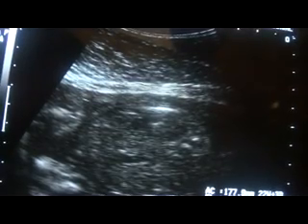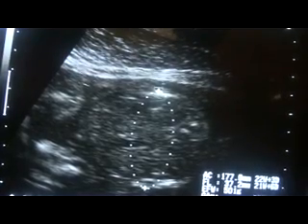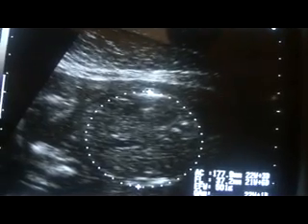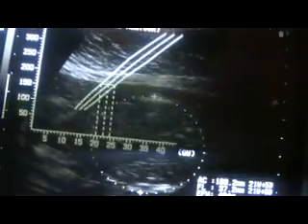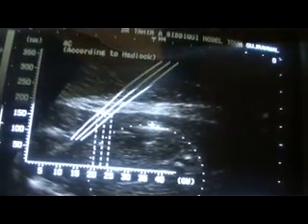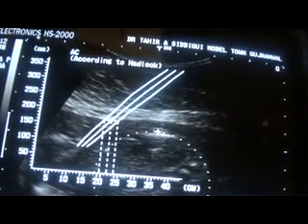Now I will move the probe further downwards to get the end of the fetus. I started from the epigastric region and am coming down. Here I am — this is the body of the fetus and I am continuing to scan downward.